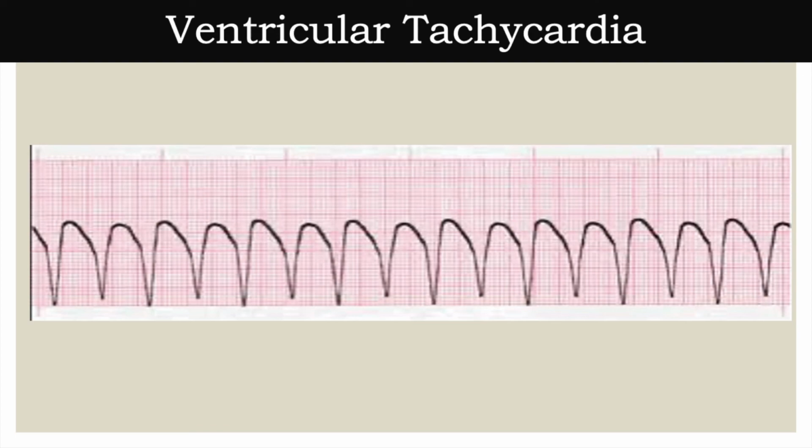So remember what I said about the ventricles, that anything that has to do with the ventricles, we're going to be giving lidocaine. Okay? So for ventricular tachycardia, basically they look like ghosts. If you draw little cute faces here, like I think I could do it. No, let me not even try. But yeah, think about little cute faces.